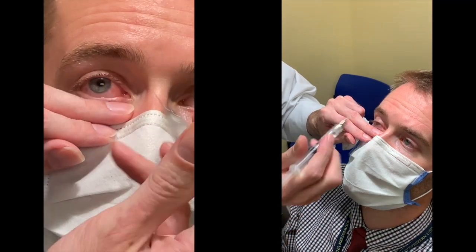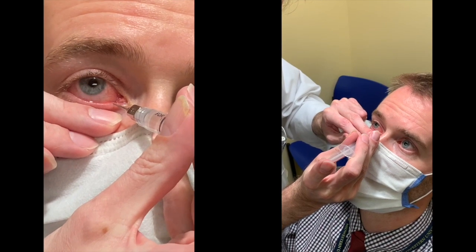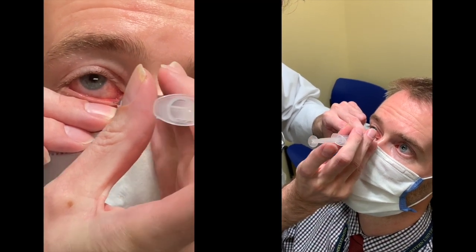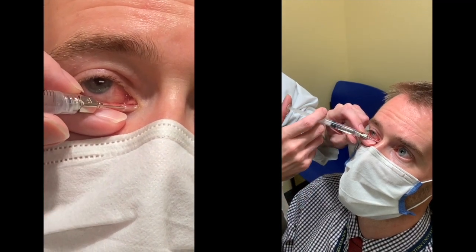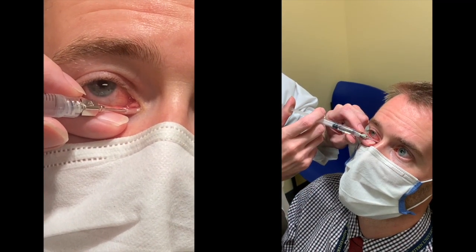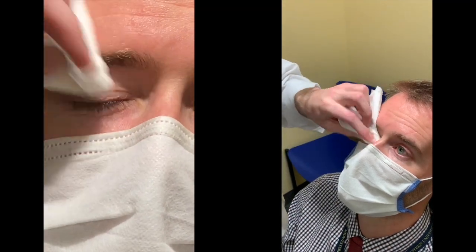I have my syringe ready to be able to enter that exact same punctum I just dilated. I go in until I hit a resistance, go around, and push forward before I irrigate. As you can see, I use my other hand to stabilize.